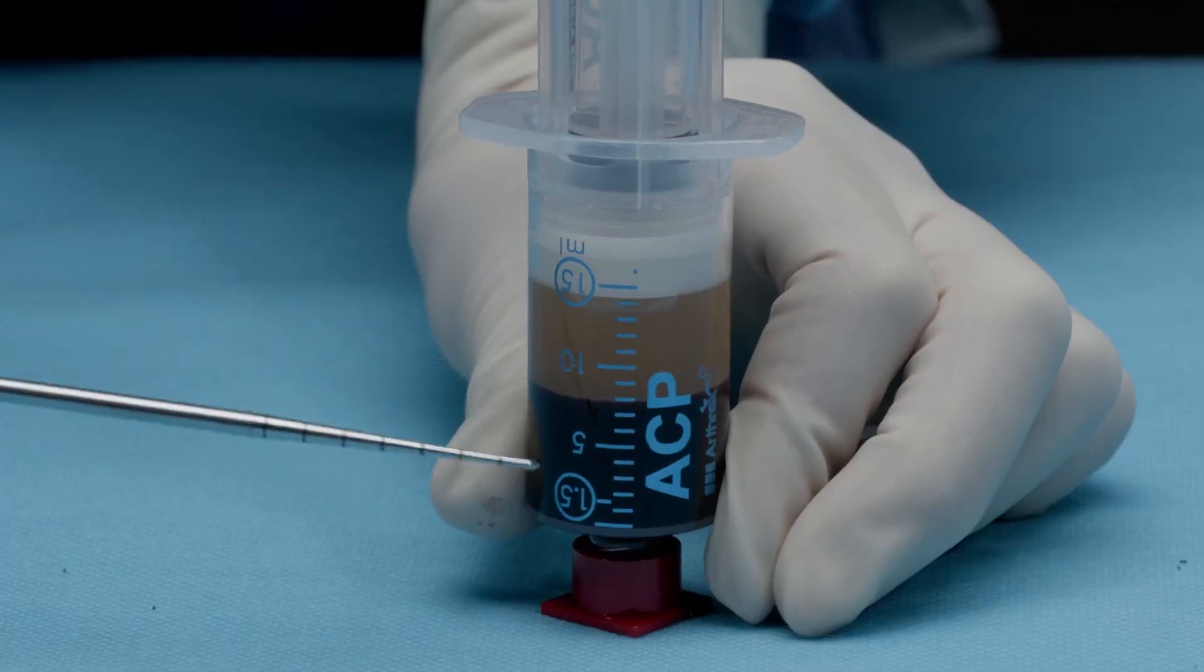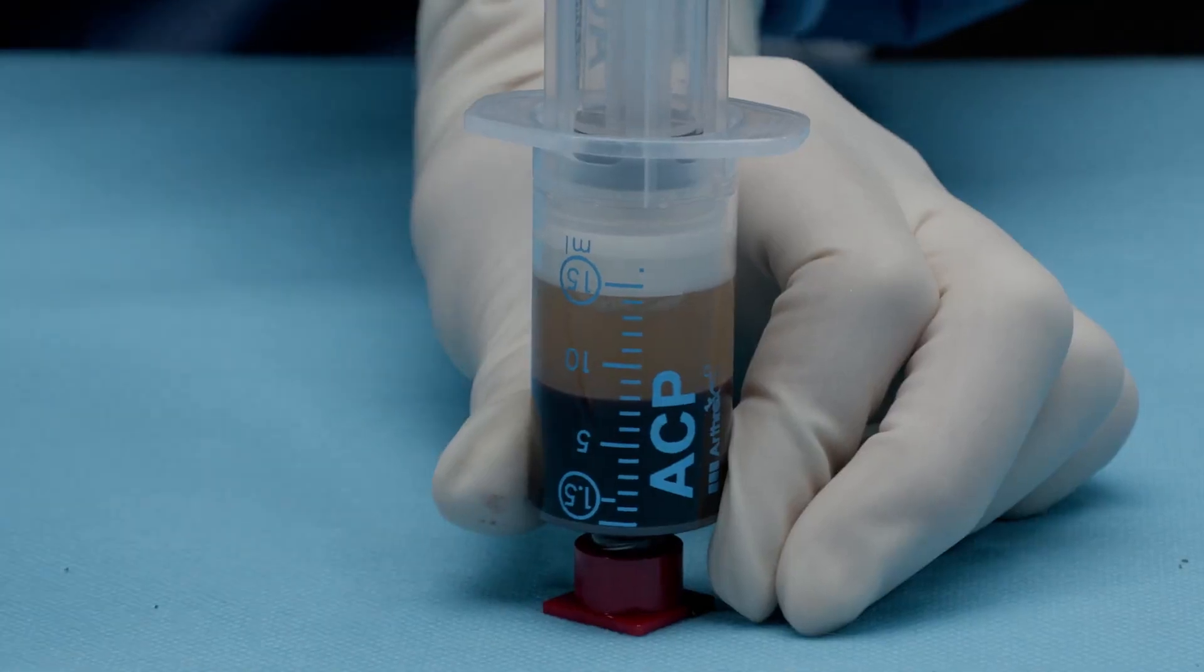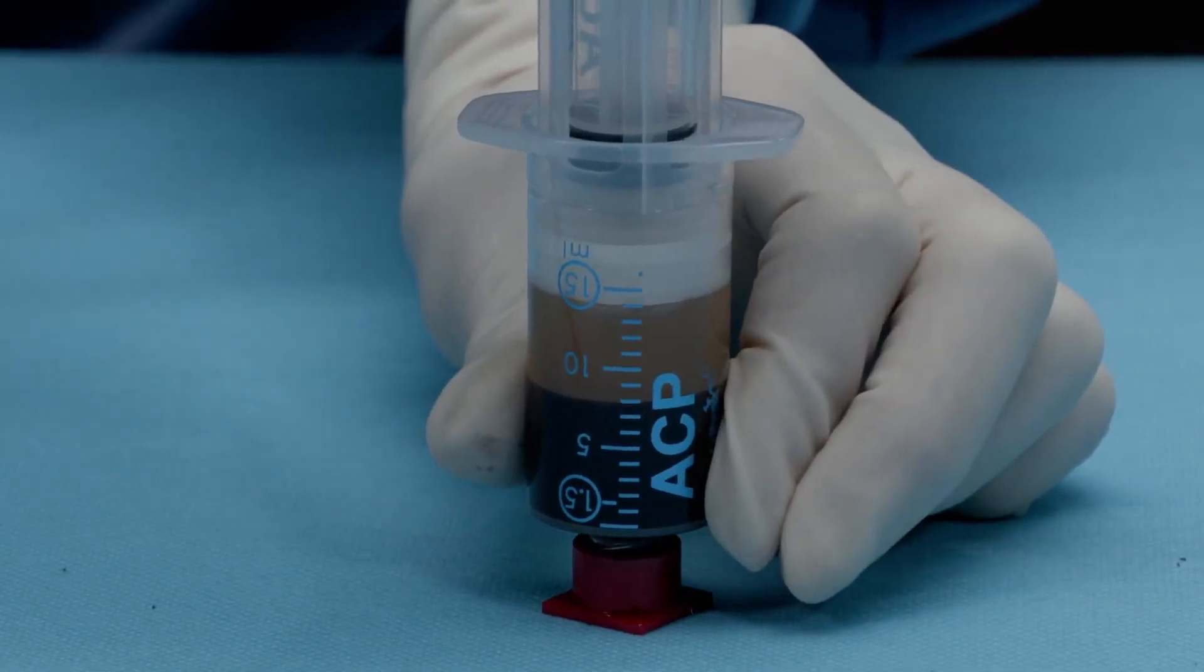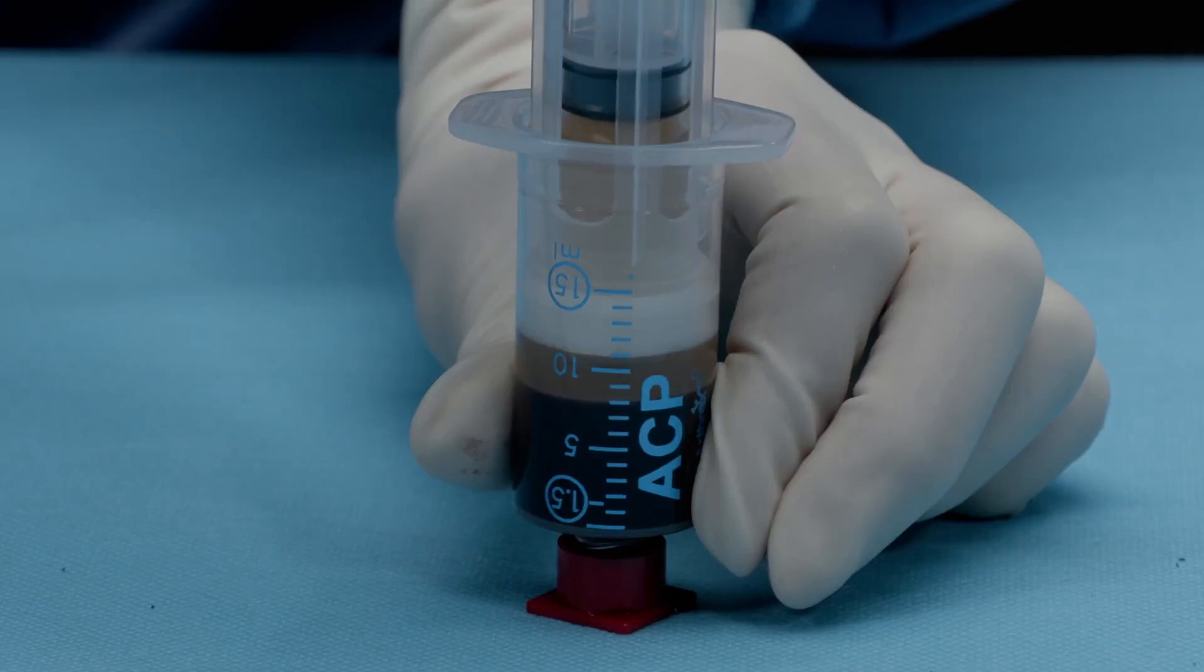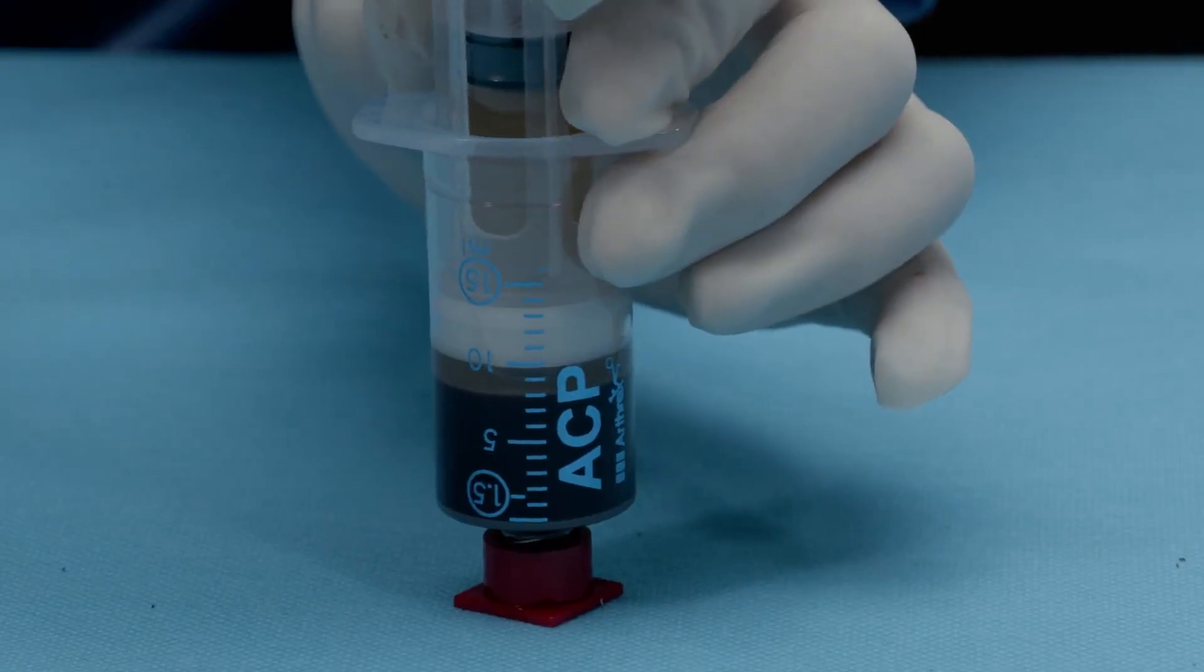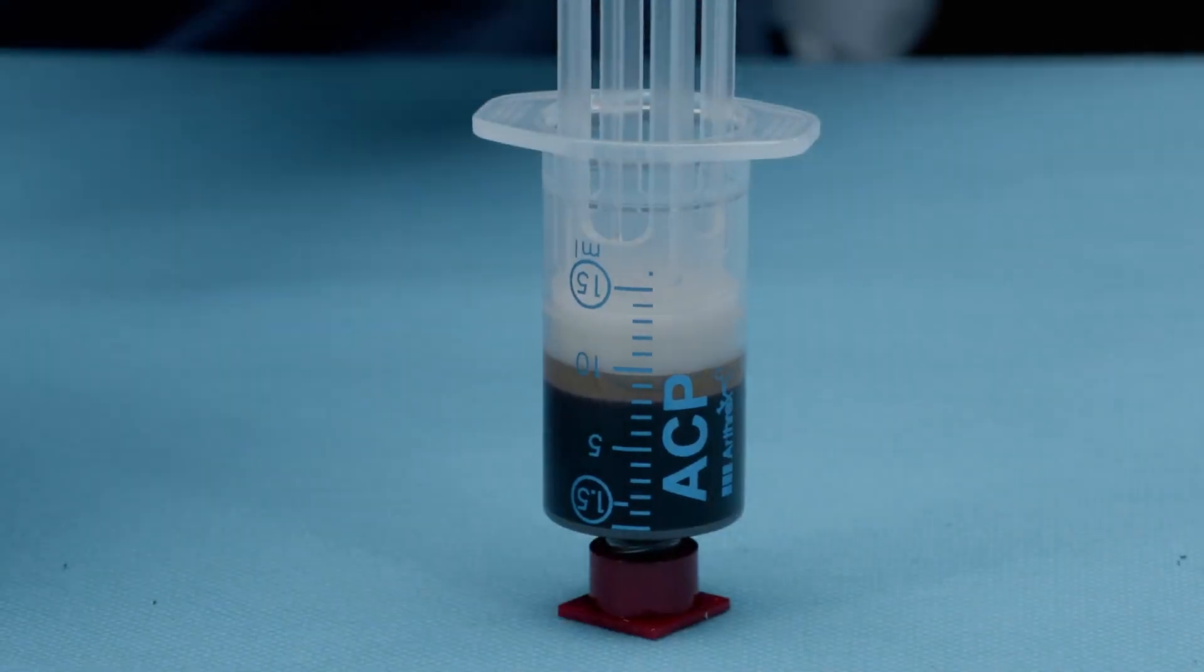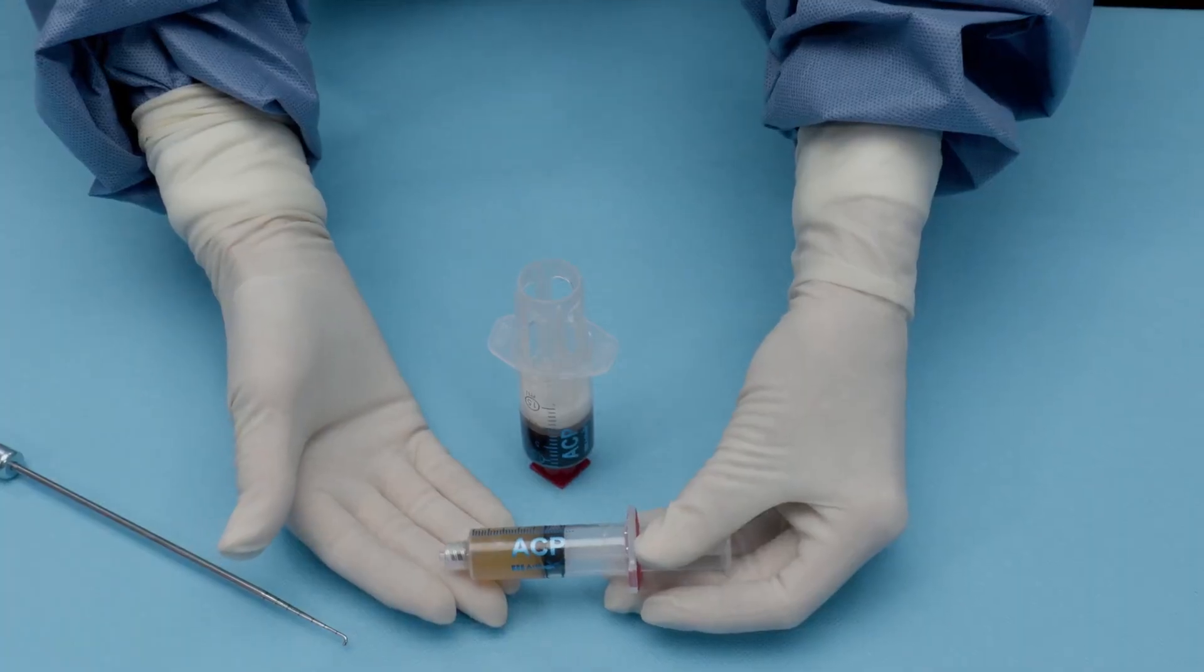After our second spin, in our ACP double barrel syringe, you're going to see your PRP product separate nicely from your red blood cell layer. At this time, you're ready to withdraw your final product. You're going to hold the base firmly, and you're going to pull off your PRP product without pulling up any of the RBC layer. So you're going to stop right above that RBC layer. You're then going to hold the barrel, unscrew your syringe, and then you have your final PRP product for use.